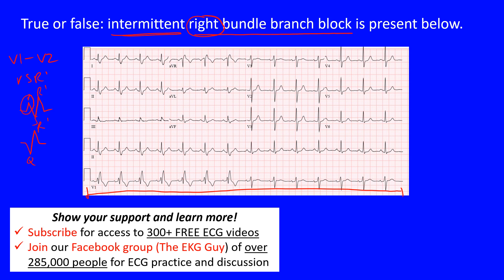In the lateral leads - V5 through V6, and even Lead 1 and AVL - you want to see slurred or wide S waves. These are prolonged S waves in the later portion of the complex. That's what you look for in V5 through V6.